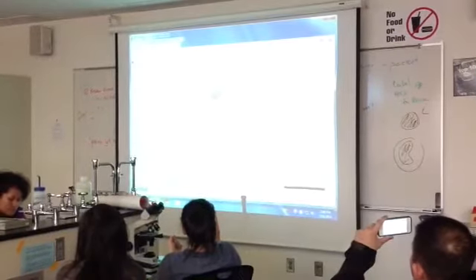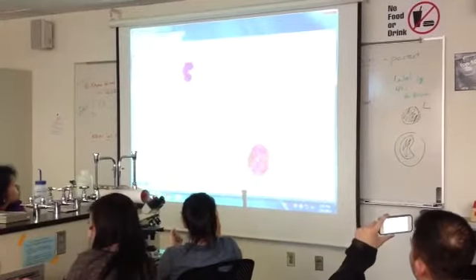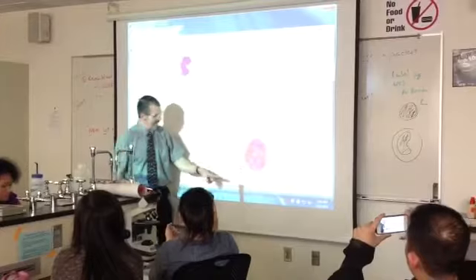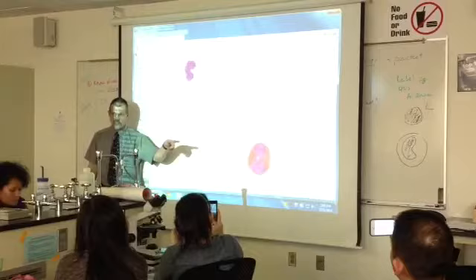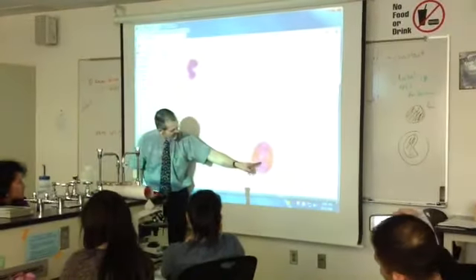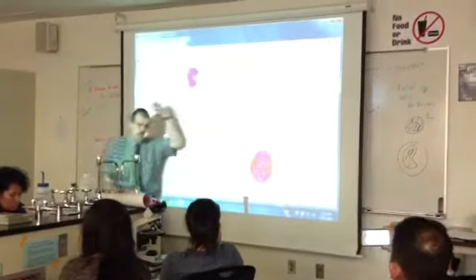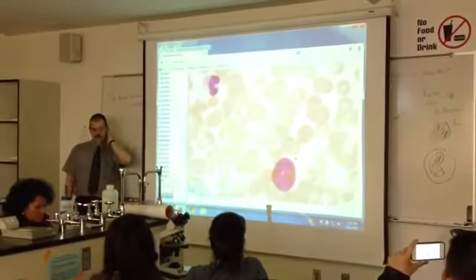Let's talk about speckles. Let's find a speckledy one. Anyone find a granulocyte for me on this picture? Right here. This is an eosinophil. That's granular, lots of speckles all over. Normally these are reddish, not always, so don't always say the red one. Normally they are. And if you can look at the nucleus, it has this weird sort of figure S, bilobed, kind of ampersand sort of shape. But it's going to be speckled enough that you'll notice it. You'll see the dots.